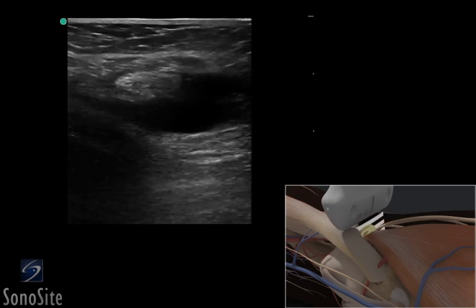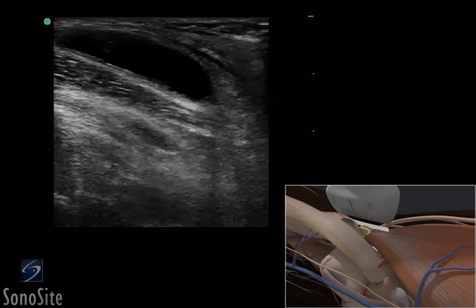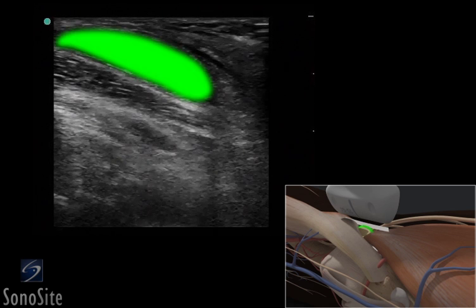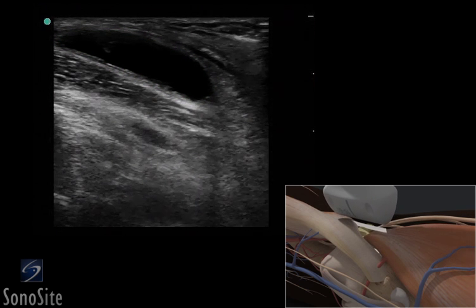The transducer is rotated 90 degrees clockwise with the orientation marker directed toward the patient's head. The extent and depth of the Baker's cyst should be confirmed by scanning the cyst proximally and distally.